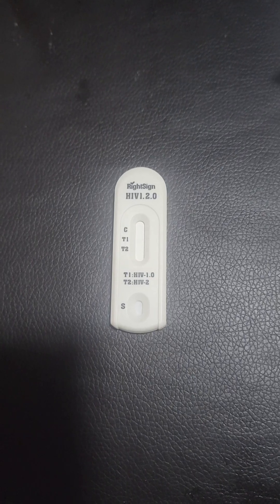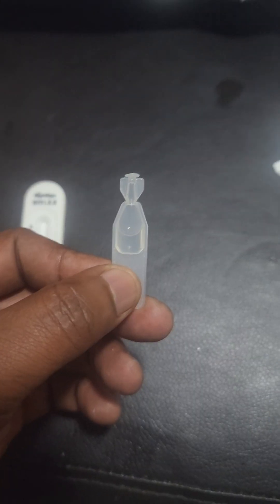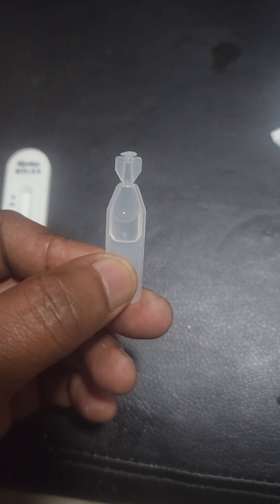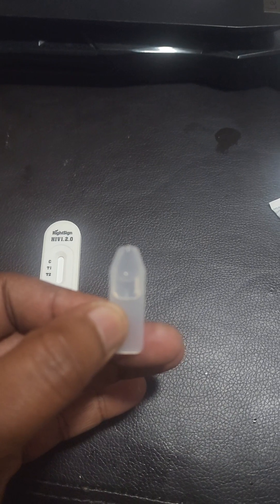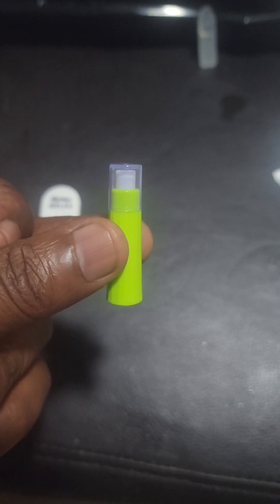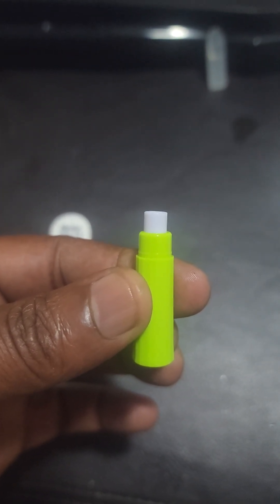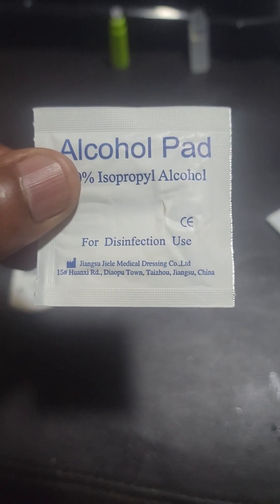When you do the test, you first put the test cartridge on a flat surface. The next step is to open your buffer solution by removing the top part and placing it on a clean surface.